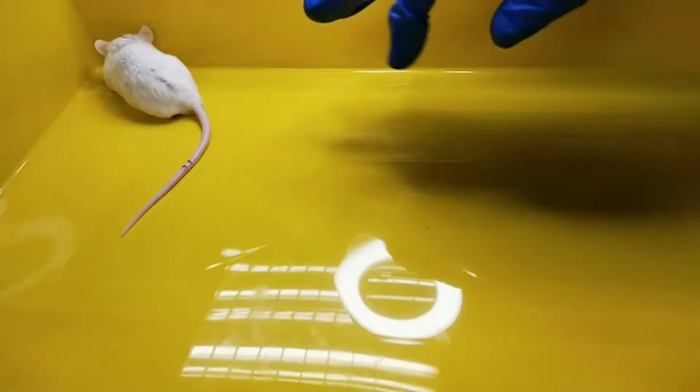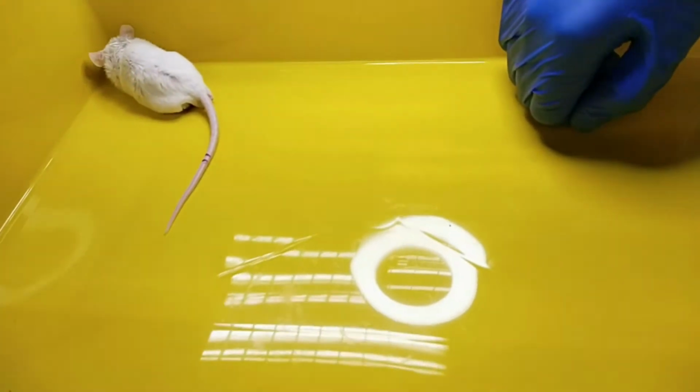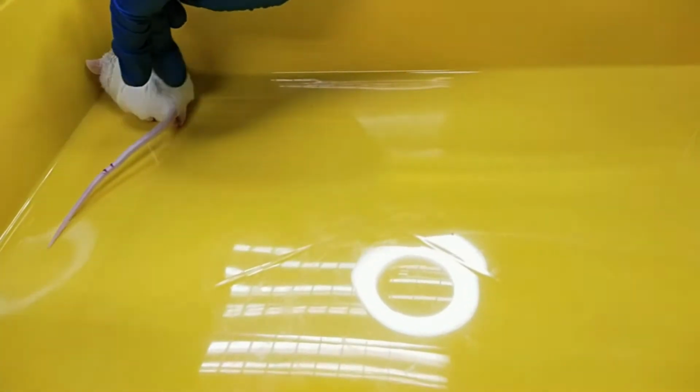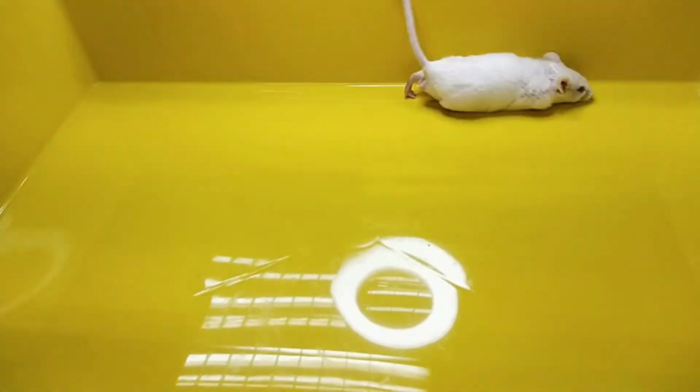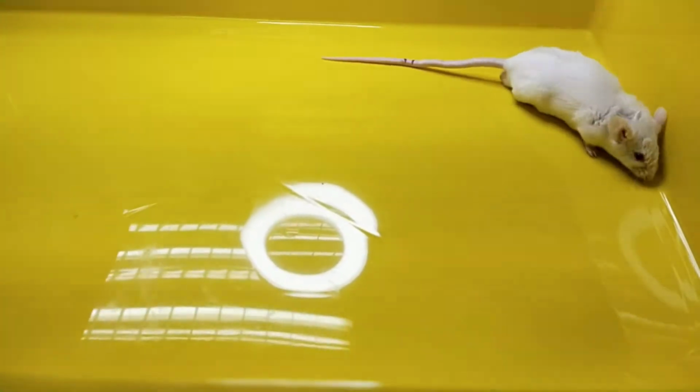So this is for the second mice, as you can see here. The way he's walking also looks imbalanced, and if you try to push him, they also are losing their reflex as well. They're unable to walk normally. So this is the time that you need to record when the animal is losing their reflex.